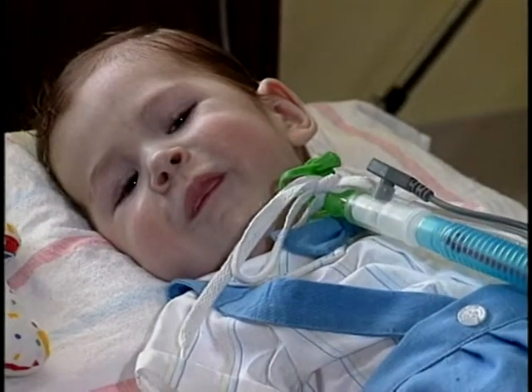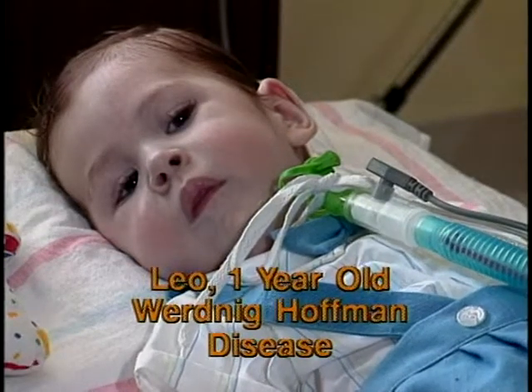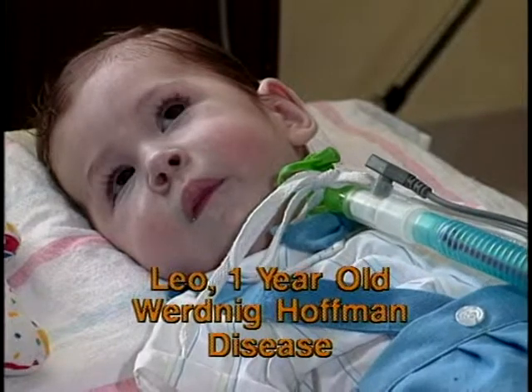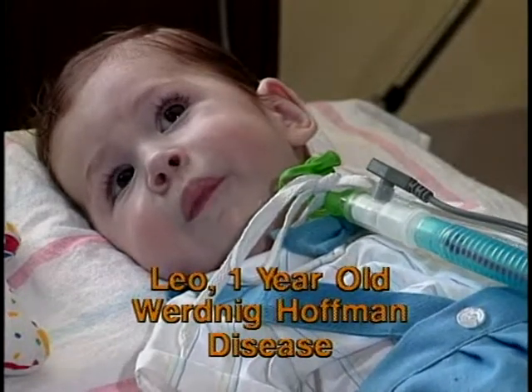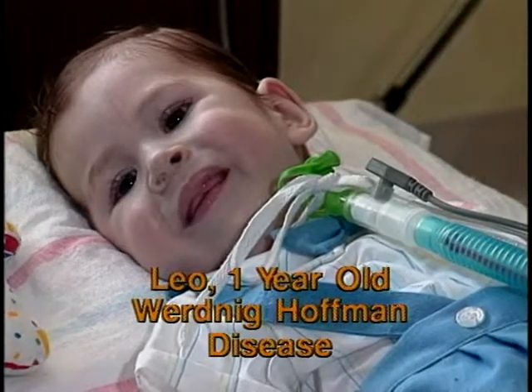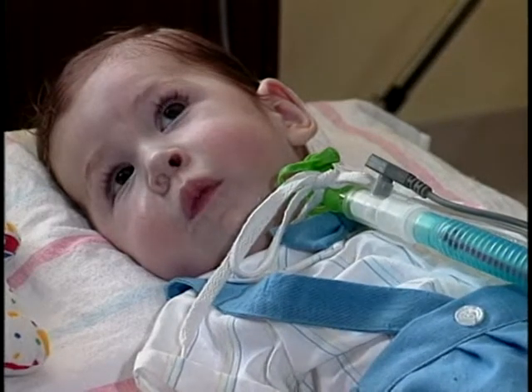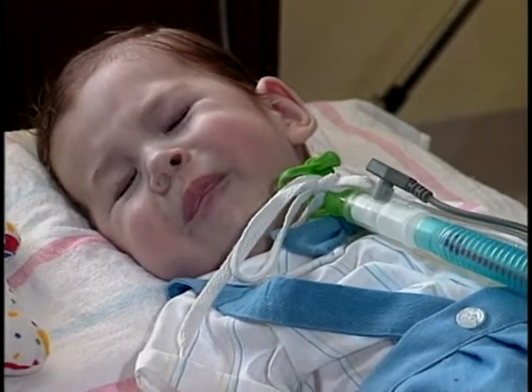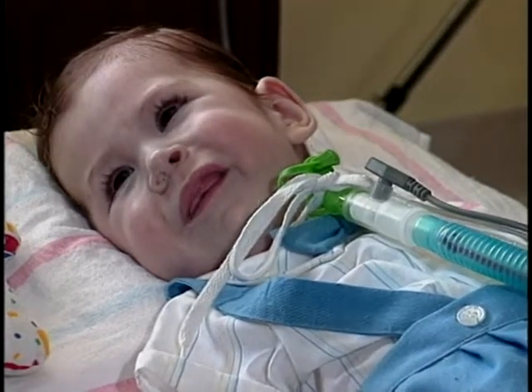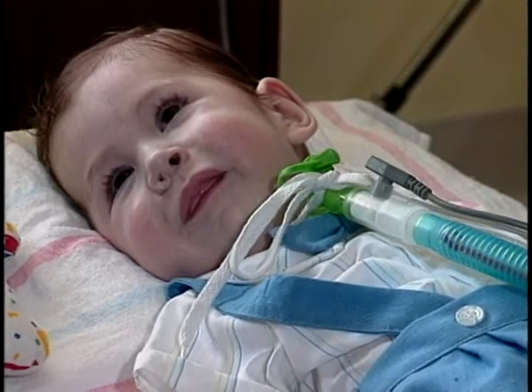This is Leo, and Leo is a little bit over 1 year old, and he has Werdnig-Hoffmann disease, which is a type of muscular dystrophy. Leo likes to jabber and coo and talk a little bit, and he's been practicing with his Passy-Muir speaking valve for the last couple weeks. What I'm going to do is put it in line, and you can hear right now that he's pretty quiet. He makes a few little sounds. Are you making sounds? Yeah? Okay, so what I'm going to do is put this in your circuit. You ready? Okay.